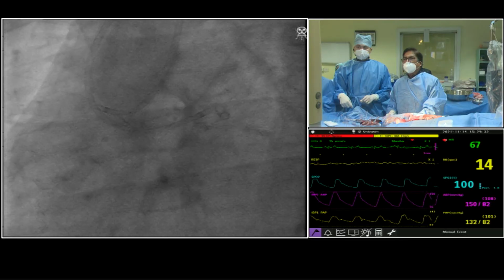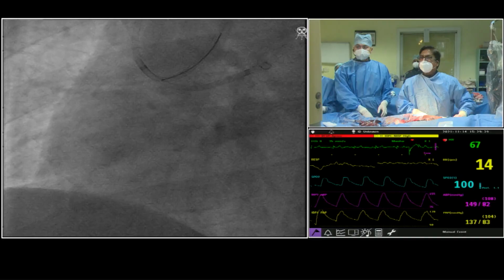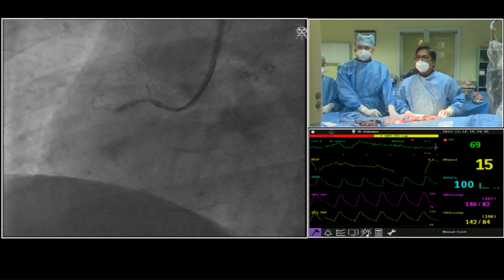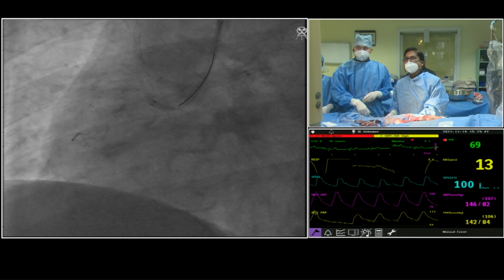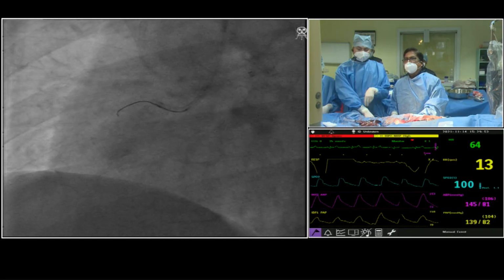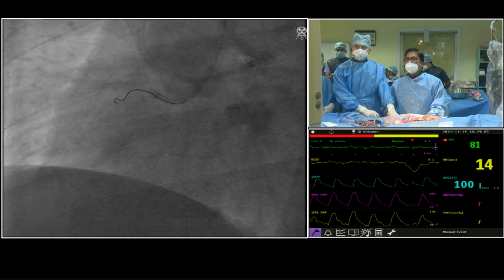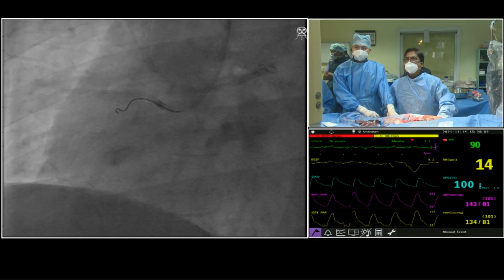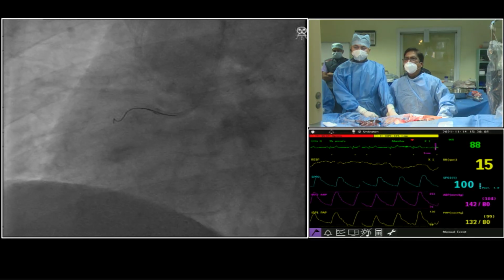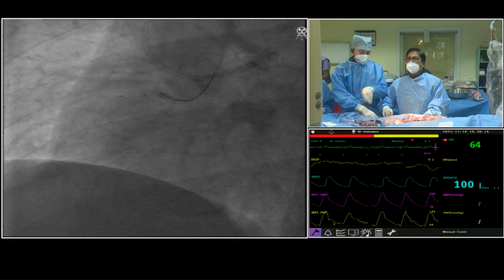Turnpike is a very good catheter. It is almost like our Fine Cross, but the support is very bad. You don't have a SAL at all? No, there is no SAL, Dr. Goel here, because I only work through SAL. SAL is an excellent catheter, especially in these types of cases, where you cannot use a full AL1, because it can damage the ostium. Your SAL is a very good catheter in these cases. Turnpike LP is also a very good catheter, especially for tortuous anatomy in the retrograde collaterals.